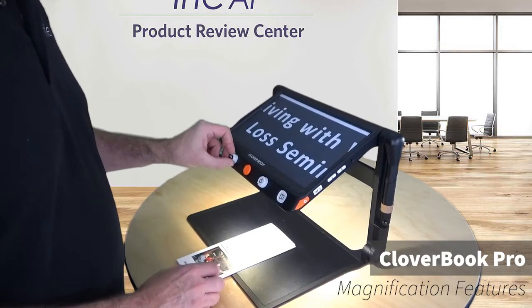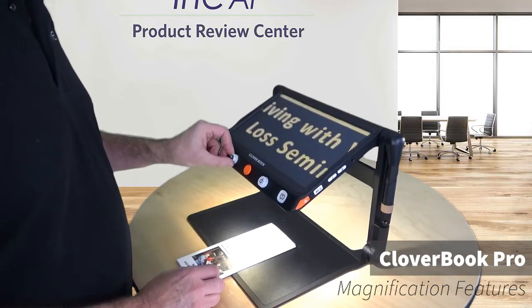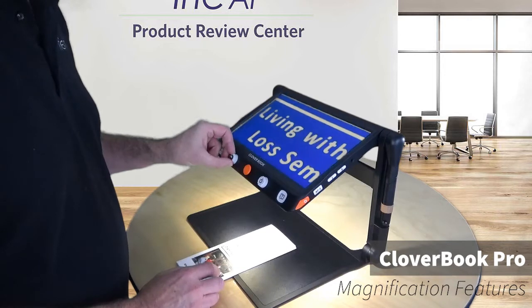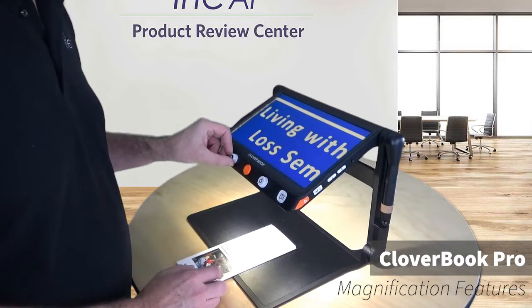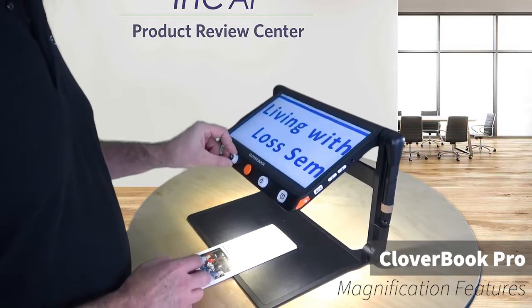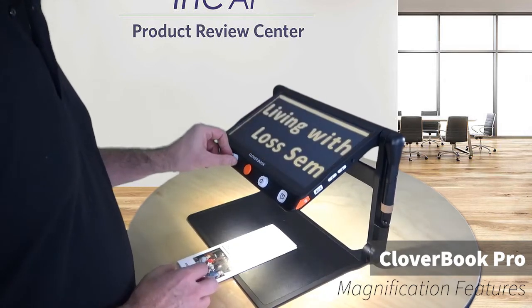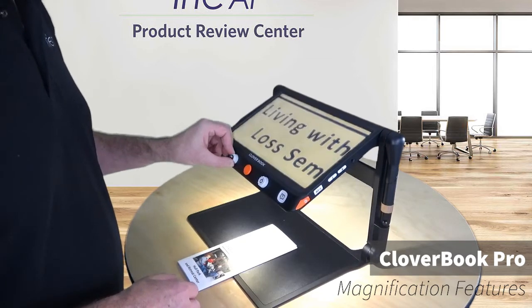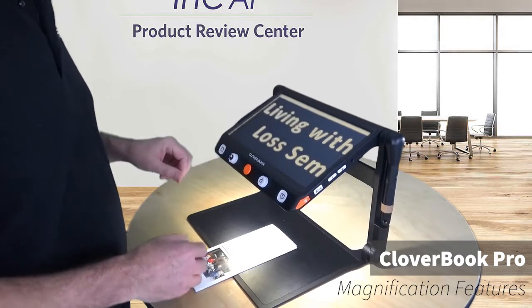magnifier. And now when I turn through the color modes, I have tons of different options. We can go into the settings and we can adjust these and turn them off if we want to. But it's nice, you can go back and forth. That's one of the things I like. If, oh, I just missed the one, now I don't have to go through 16 other ones to get back to it. I can just go back and forth.